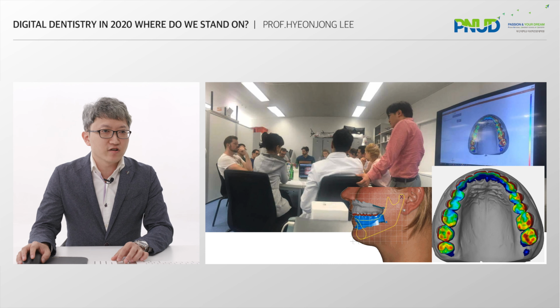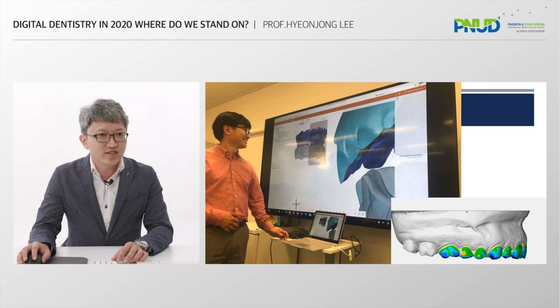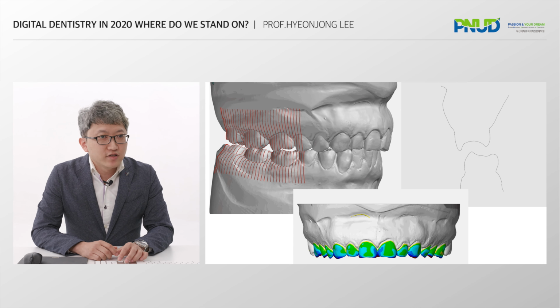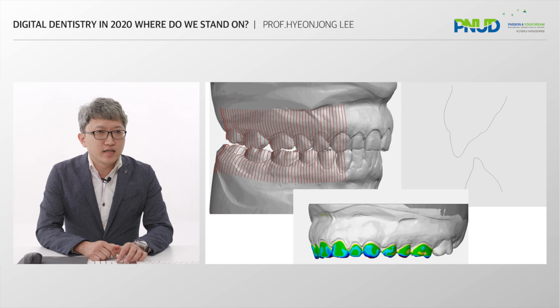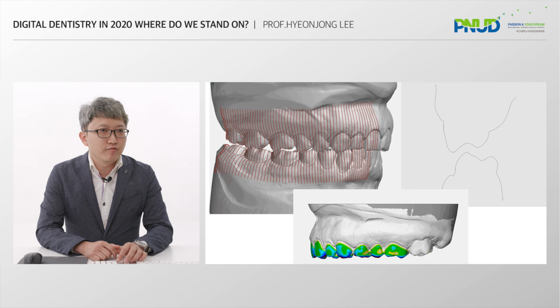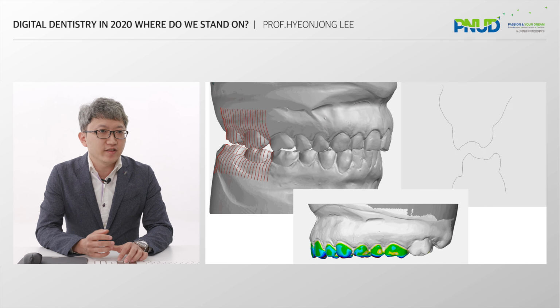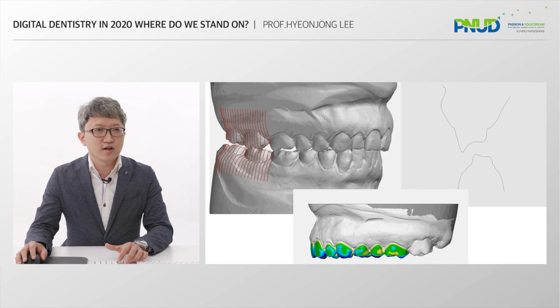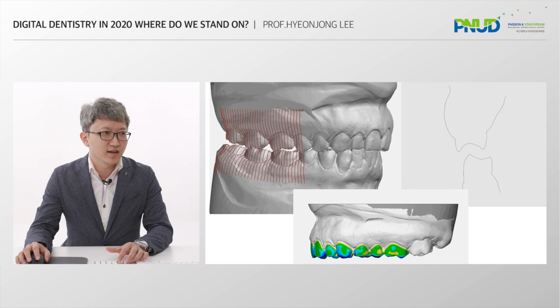This is virtual vertical dimension augmentation and its 3D analysis. I would say in this era of digital dentistry, we got two kinds of freedom. We can store 3D surface data of models, which means we don't need to store lots of stone models anymore, like this.